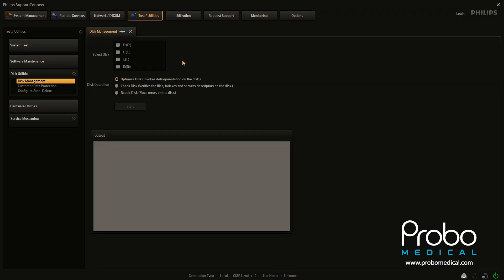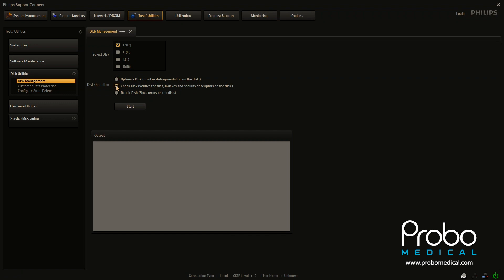So as you see now, if you're familiar with computers, this might look a little familiar to you. Basically we have a variety of different drive letters that are assigned within the unit itself, and some very typical computer-type tools that you would use to check any hard drive. You can optimize the disk, you can check the disk, and you can repair the disk. You would just check any particular partition you're interested in, click Check Disk, and then click Start. You can go through this on any of those drives and use either one of these tools that you would like.